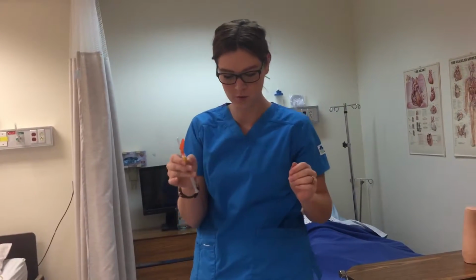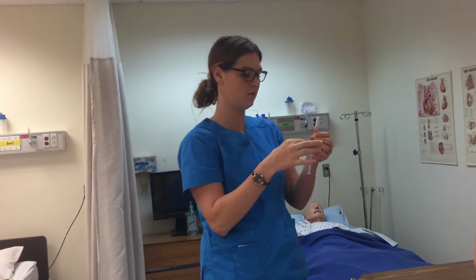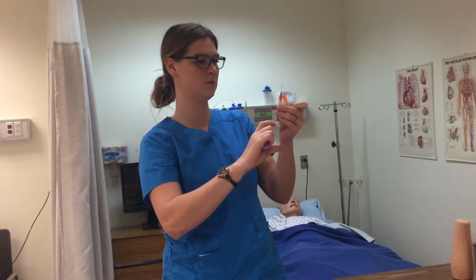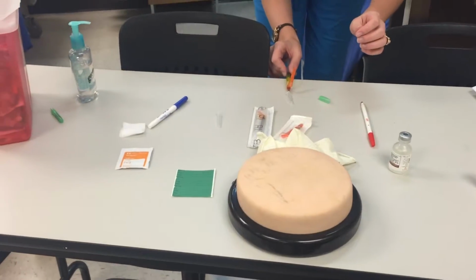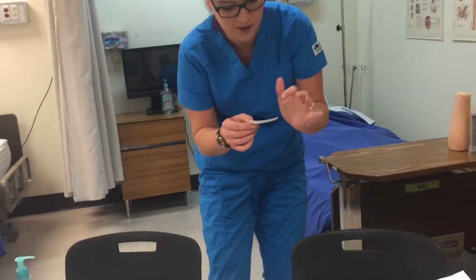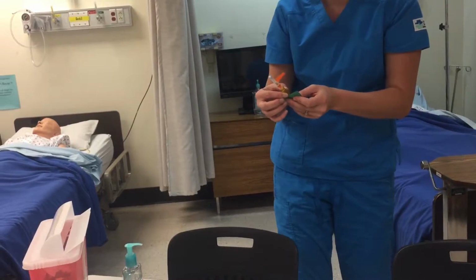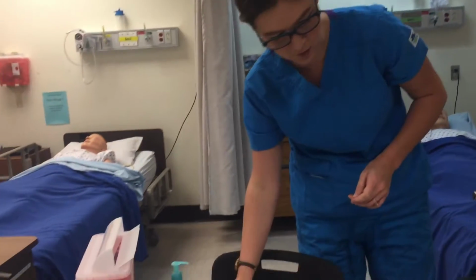Okay, so now I'm going to prime this needle. Air bubbles are up. Prime the needle. Recap it using the scoop method. And label. So I would write my medication, dose, initials, date, and time. And then I'm going to put my label around the bottom half of the plunger. There's one that's prepped and ready to go.